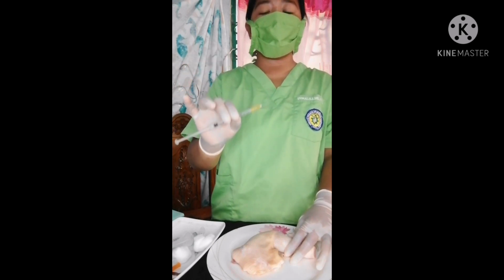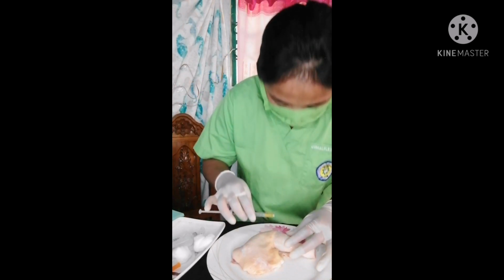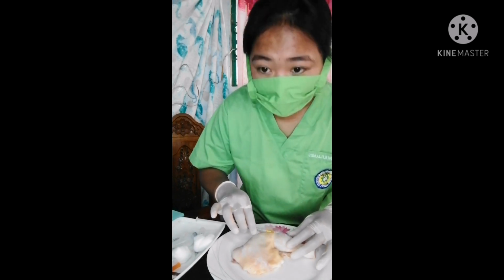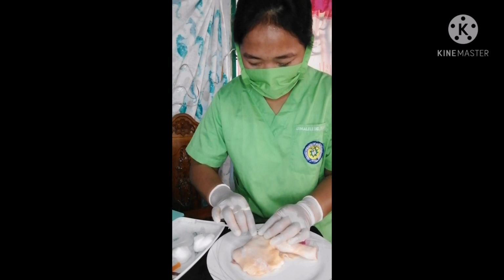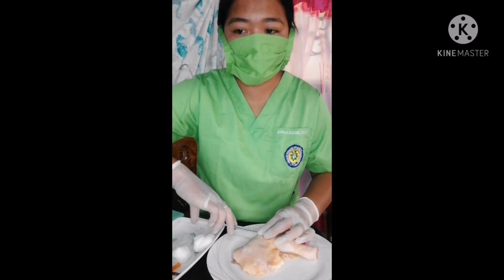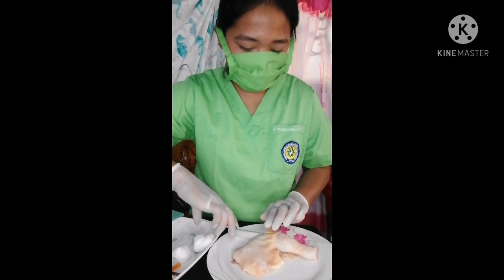Insert the needle into the skin so that the point of the needle can be seen through the skin. Insert the needle only about 1/8 inch, until the bevel is under the skin. Once the needle is in place, steady the lower end of the syringe. Slide your dominant hand to the end of the plunger. Then withdraw the needle quickly at the same angle at which it was inserted.